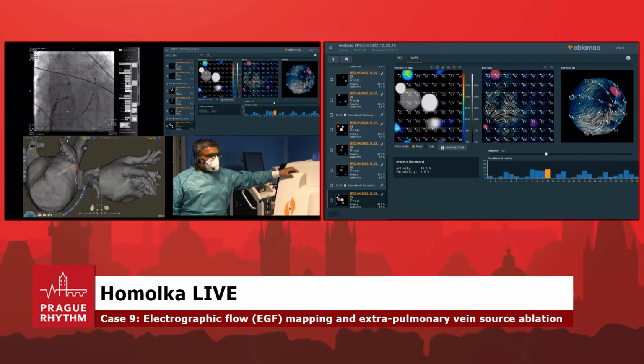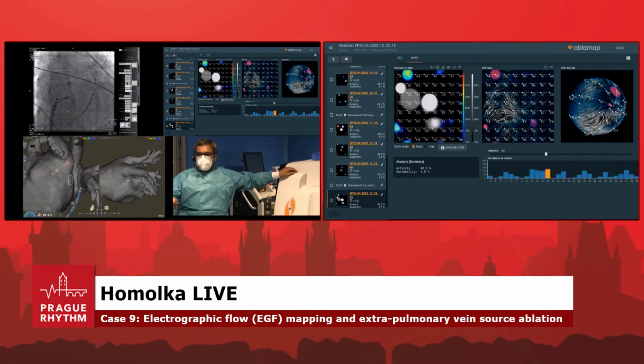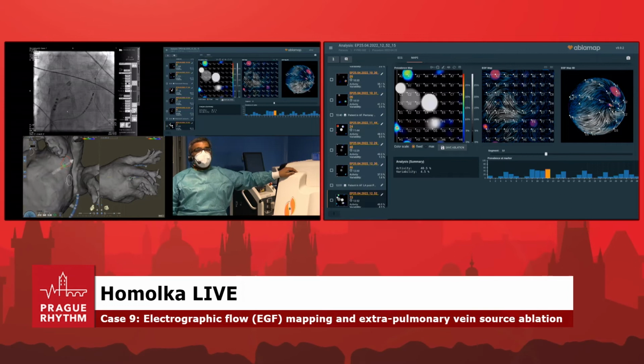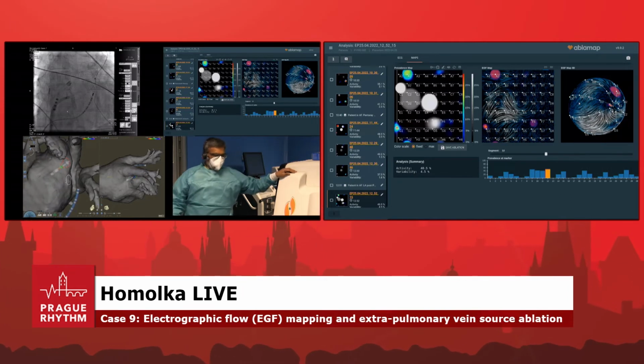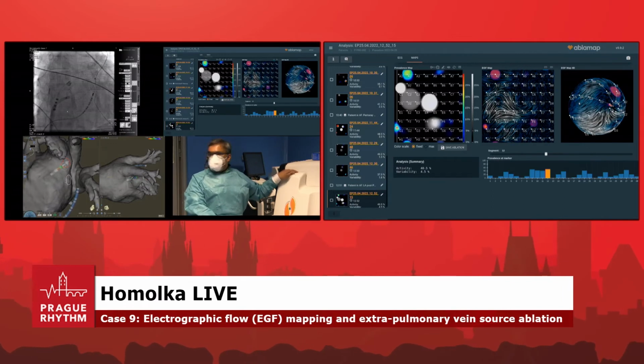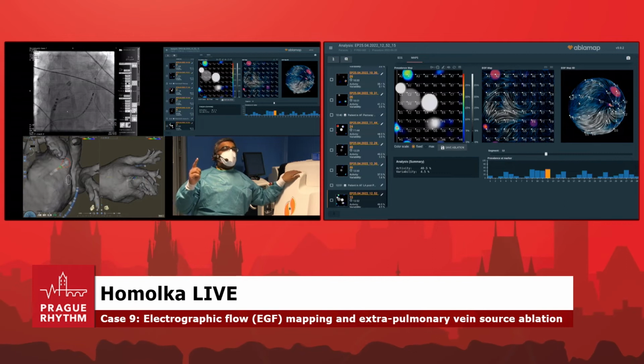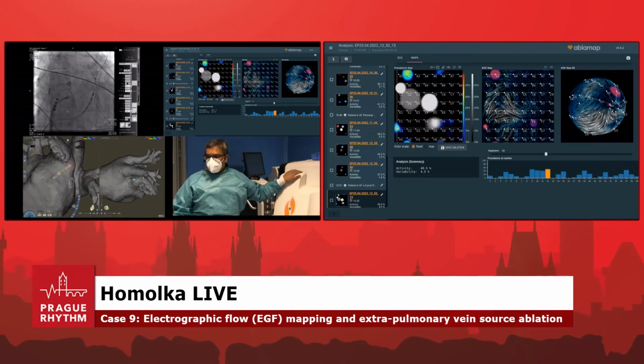So we're ready to ablate. We're done? Okay. So now we're doing the analysis here? 30 more seconds, okay. It's being analyzed in their software, and in just a minute we'll see what it shows. Let's show them, oh, they see the EGF screen. Okay, good.